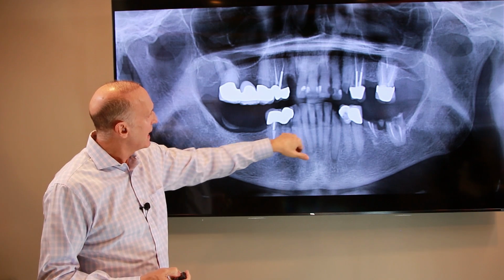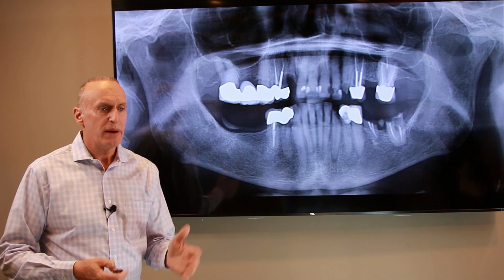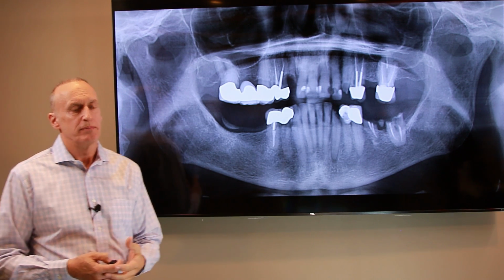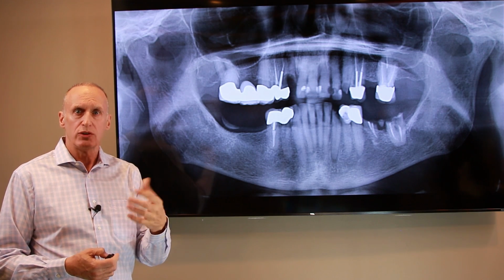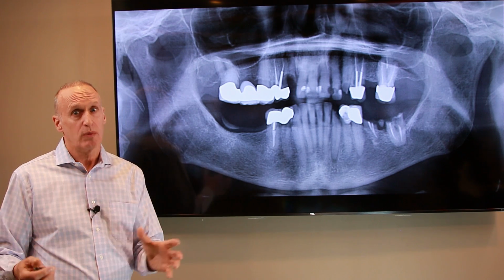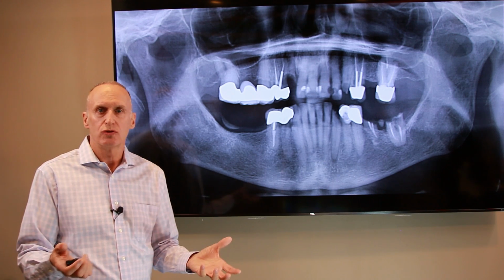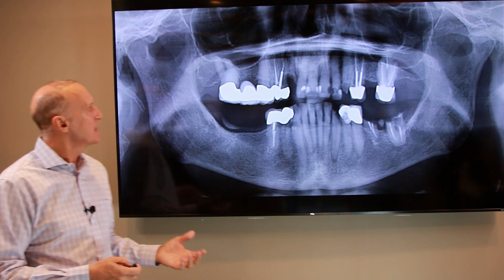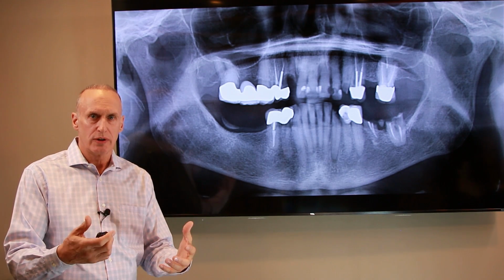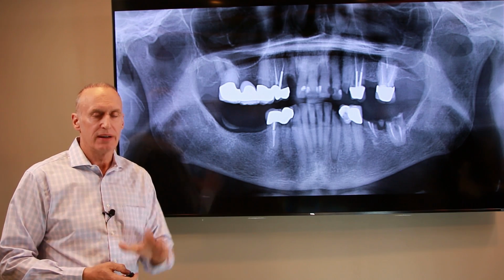You can see the size of some of the cavities and some of the broken teeth because of the cavities. But every patient has a different level of bone density, and it's usually a genetic thing. If you have soft bone, we usually can't put temporaries on your implants on the day of the first surgery. And that was always a problem because that interim time of wearing a temporary denture caused the tissues to change in a negative way. So I start all these surgeries off as a staged treatment, meaning we're going to have to come back and do a second surgery 2.5 months later. And here's how it goes down.